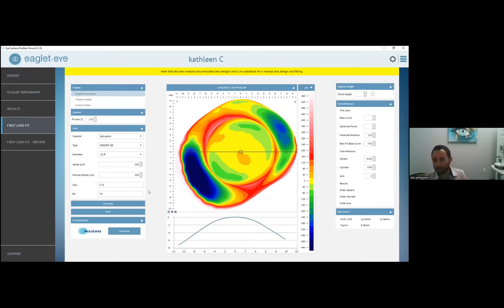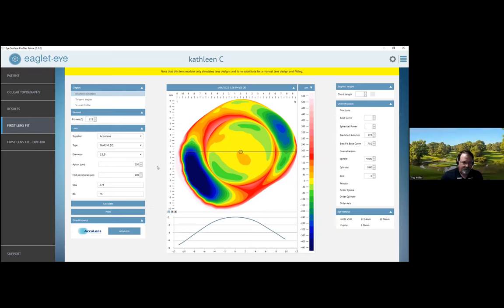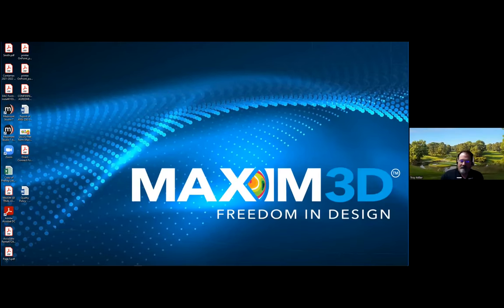Troy, do you want to take over and show everyone what this looks like on the back end? Sure. Thanks, Dr. Gibberman. We'll start from the point where Alex selects a good scan and sends it through Direct Connect, and I'll show you exactly what we see on our end.